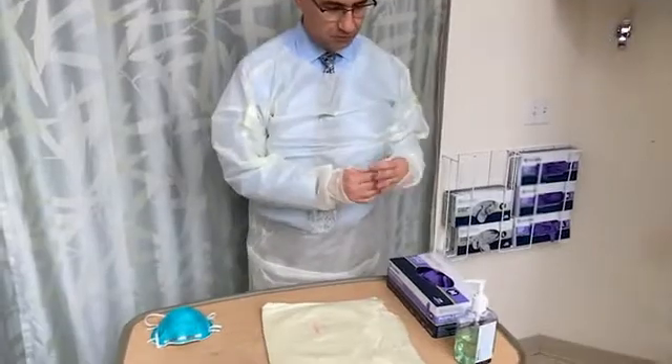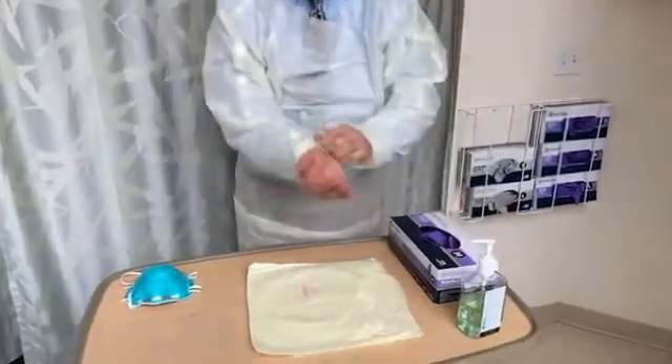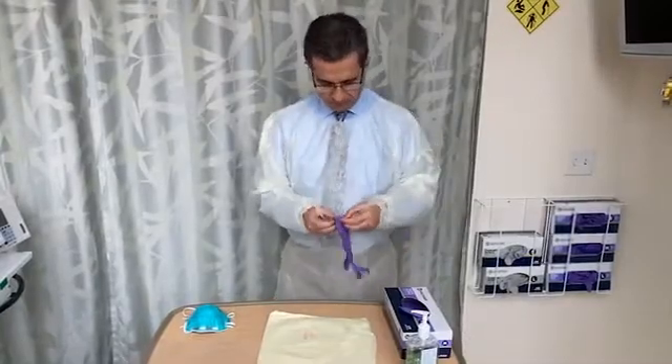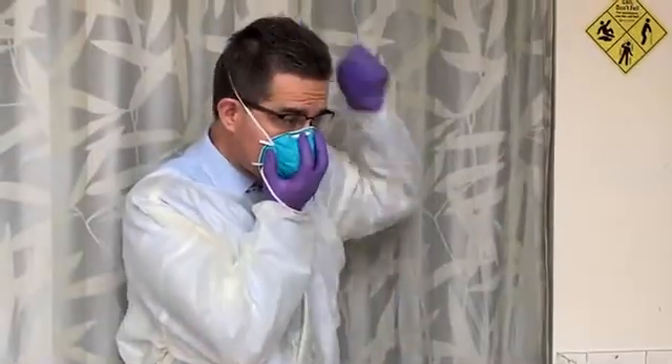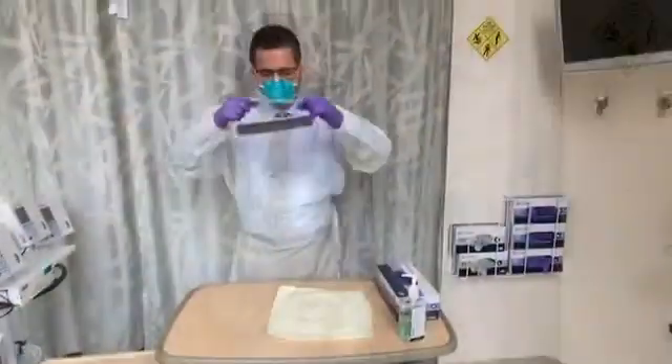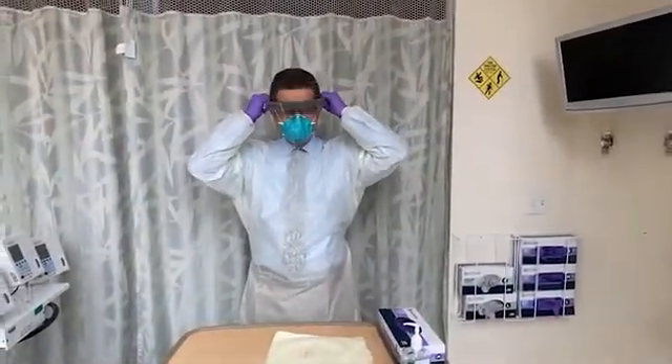First, put on a protective gown and wash your hands with soap and water, or use an alcohol-based solution, and put on a pair of non-sterile gloves, followed by a protective mask with a rating of N95 or higher, as recommended by the CDC. Finally, put on a face shield for eye protection.